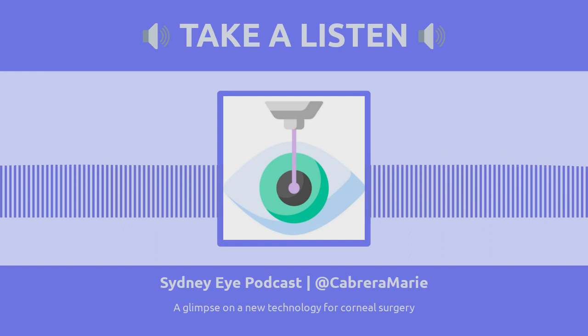For example, when we did this technology on an enucleated eye, essentially this eye has no more eyelids left. When we put a patch on, we don't have to do anything, we just leave it there. However, with eyes with an eyelid, we find that sometimes the eyelid can push the film off because of the sweeping effect of the eyelids, and sometimes a bandage contact lens could be helpful.